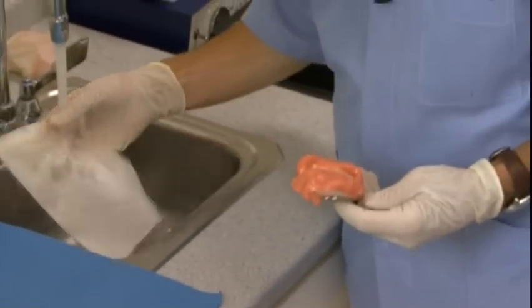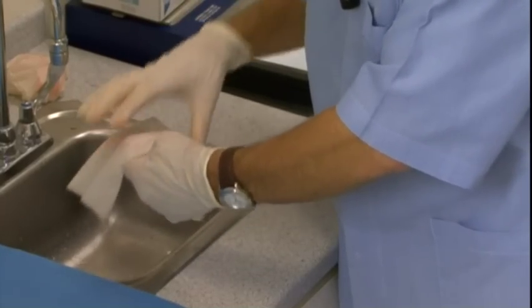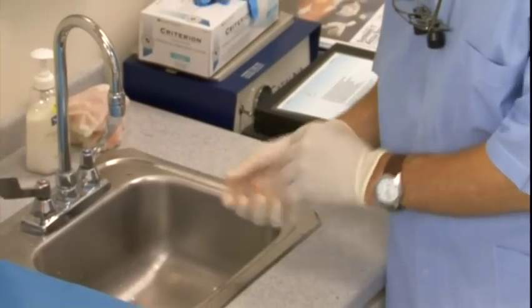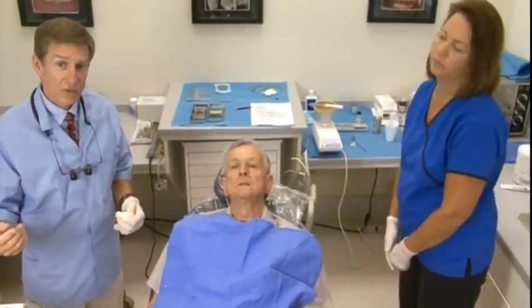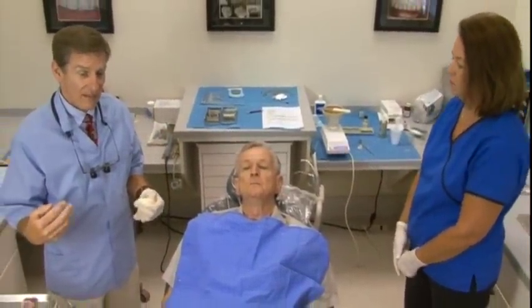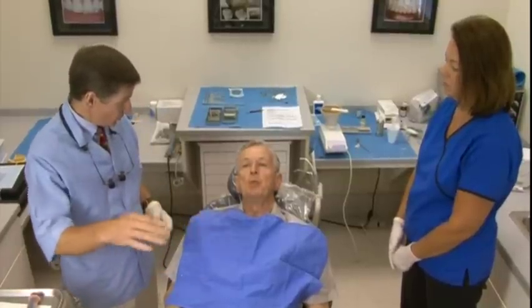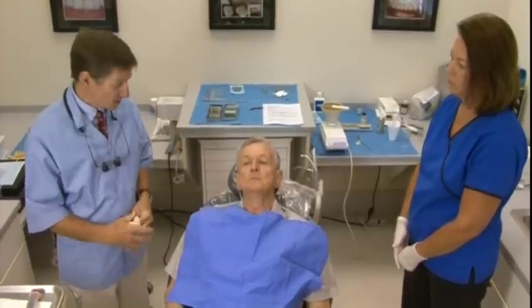We're going to do the same thing — wrap it in a wet paper towel. We have a full wet lab in our office, so Kathy serves as our lab assistant and my son Jimmy helps out too. We'll create a pan with Mr. Bothy's name and the date, and we have a routing slip that tells us where it goes, what needs to be done, and when Mr. Bothy's next appointment is.